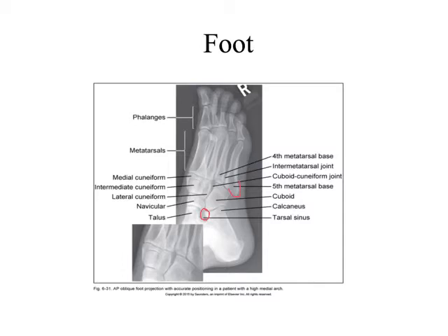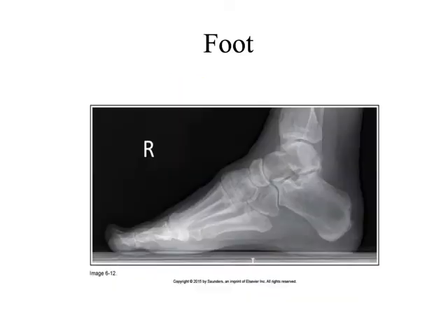Let me see if there's anything else. And at the same time, the third metatarsal is still at the center of our exposure field, all right? So we've included all the soft tissue. This has an actual standard marker. All the soft tissue is included, aligned to the axis of the long bones of the foot, and we're centered more or less on that third metatarsal. Okay, lateral foot.